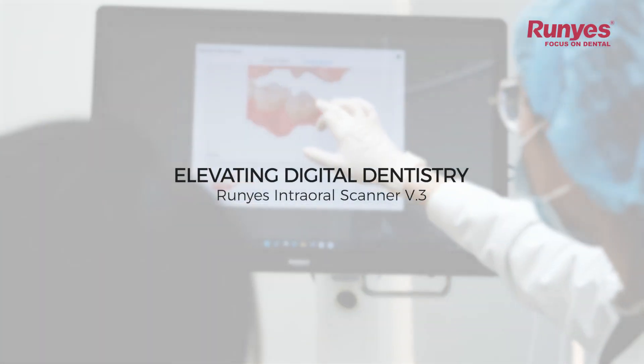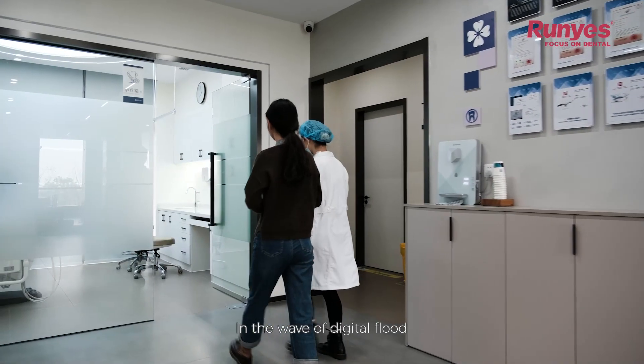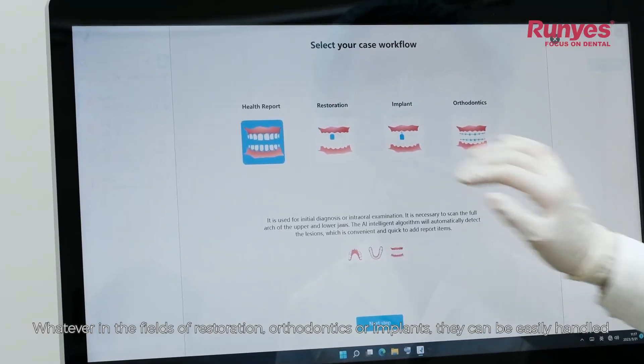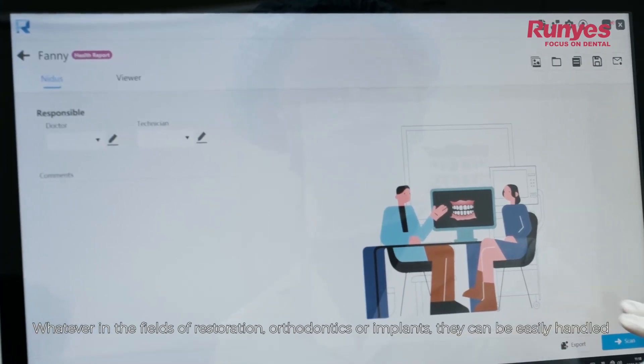Elevating digital dentistry — Runyes Intraoral Scanner V3. In the wave of digital dentistry, if you are looking for a more modern and efficient oral treatment product, whether in the fields of restoration, orthodontics, or implants, they can be easily handled.